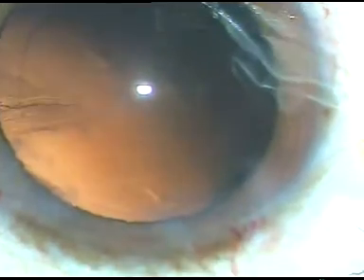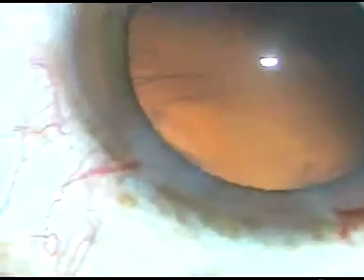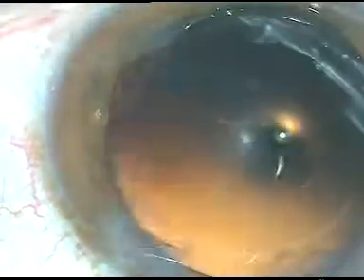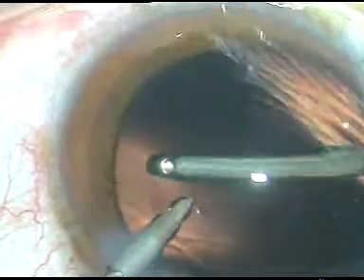This is the cortical matter at 1 o'clock — it has come out. Some cortical fibers are sticking to the posterior capsule at 3 o'clock and some at 7 o'clock. The 7 o'clock fibers are dislodged and come out. The 3 o'clock fibers are separated from the posterior capsule but are attached to the equator, so I use bimanual IA — irrigation from the left side, aspiration from the right — to remove the cortical fibers at 3 o'clock.